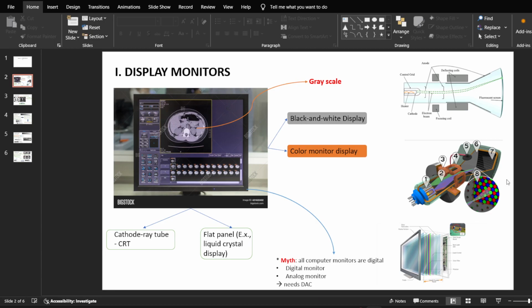LG or Samsung maybe, but we prefer LG, because of its quality and other things behind that. So first of all, the two most common traits of a display monitor: first, resolution; second, the inch, or you can say the size of our screen.